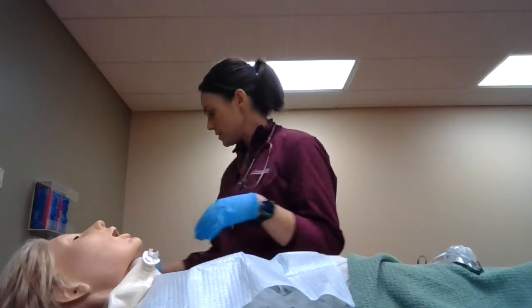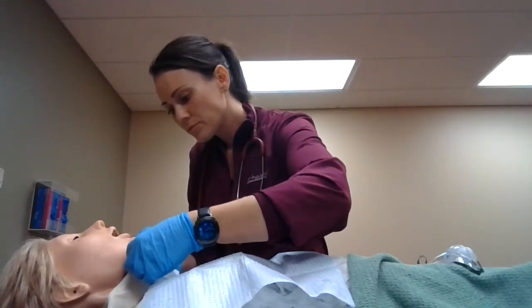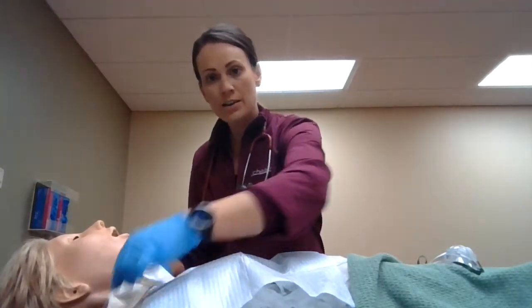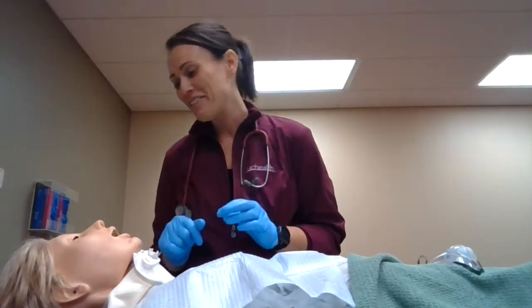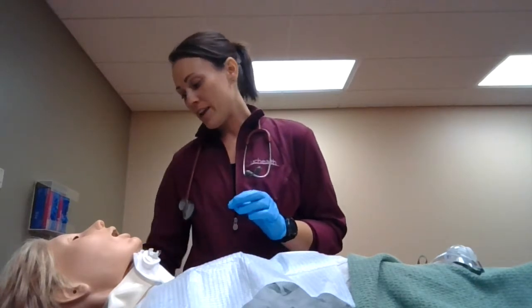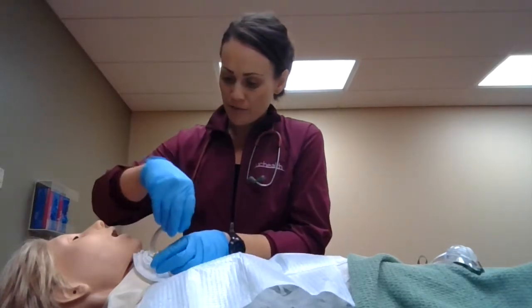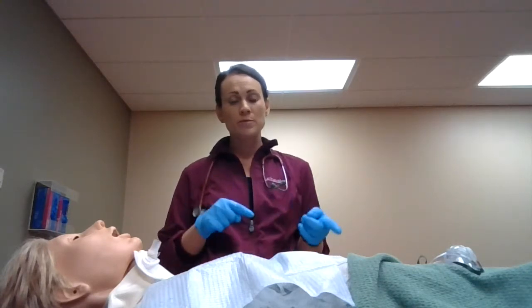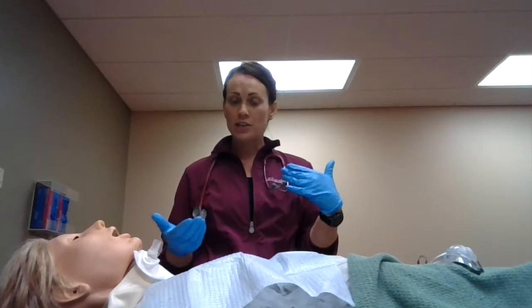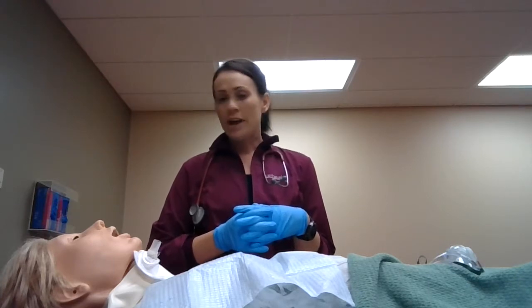We can go ahead now and put a new gauze on, making sure it's secure and dry with no drainage. I'll go ahead and tie a new secure neck tie on her trach. Then we'll monitor her cuff pressure and make sure we have the new inner cannula in. We always make sure we have spare inner cannulas in the room — one a size smaller and one a size bigger — in case there's any change in anatomy, swelling, or compromise of the airway.